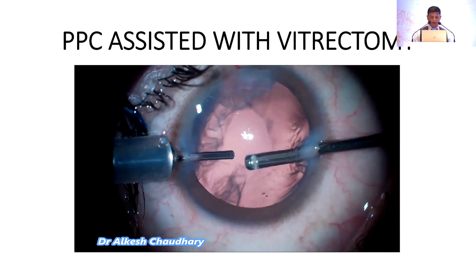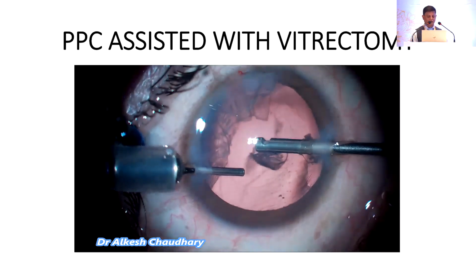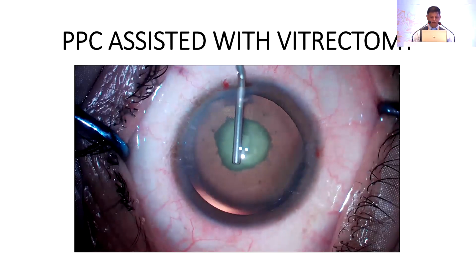Cutting should be off while you are under the anterior capsule, just to avoid damage to the anterior capsule. We retain the anterior capsule nicely, just cutting on, cutting off. So that is the technique to remove this cortex.